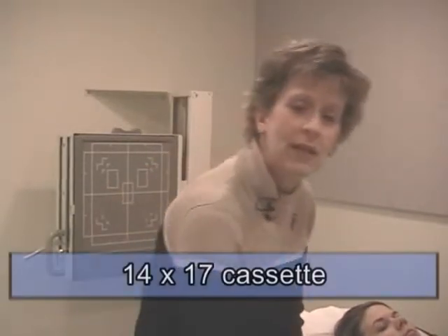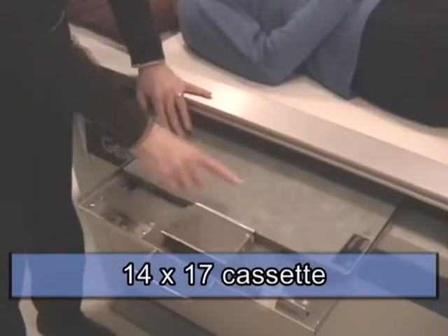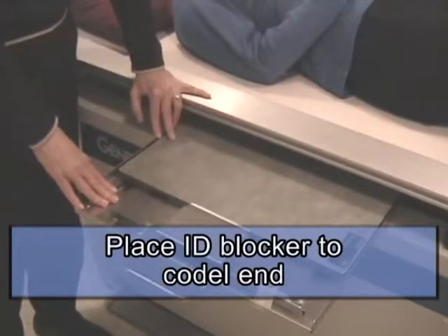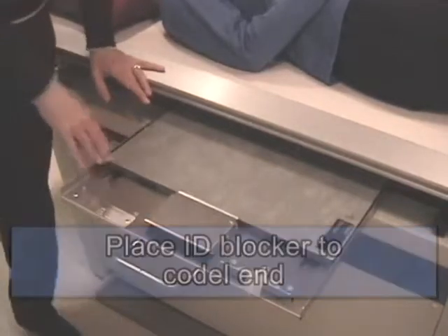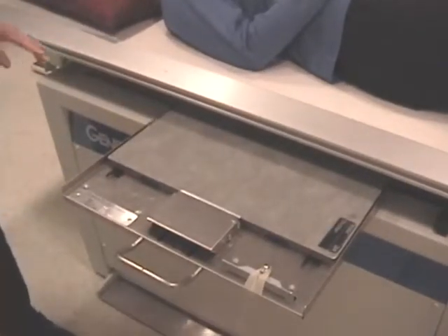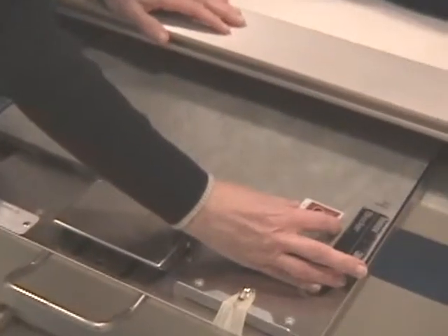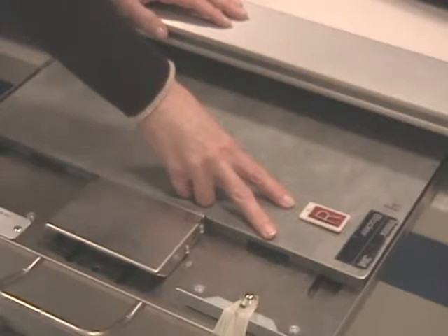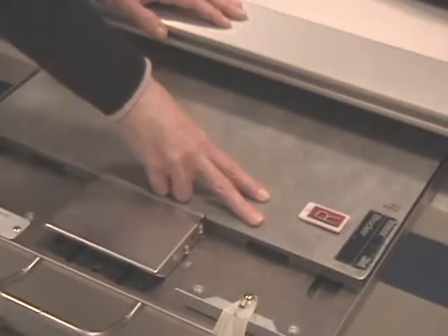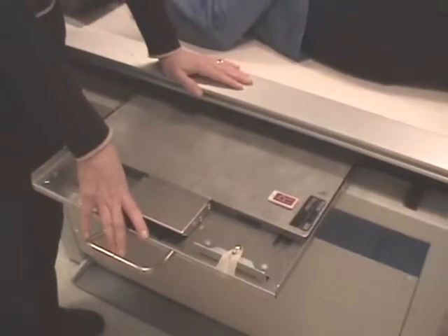I have a 14 by 17 cassette in the Bucky tray, and we've placed the ID blocker to the caudal end. In setting up your room, you do put the cassette in the Bucky tray, and I'm going to move my marker in a little ways because I'm going to show about 2 inches of collimation on both sides of the cassette. Some departments will collimate tighter in order to focus right in on the lumbar spine itself.